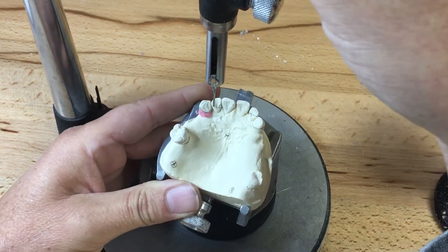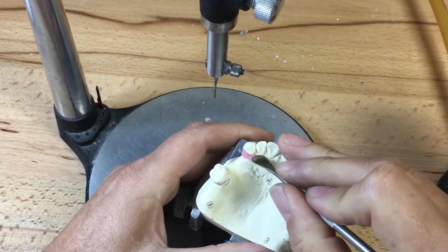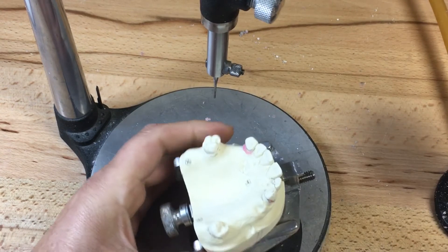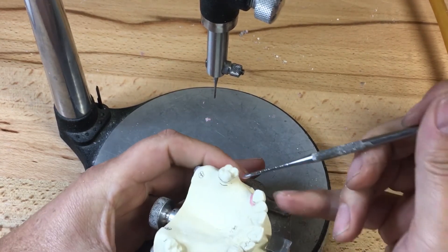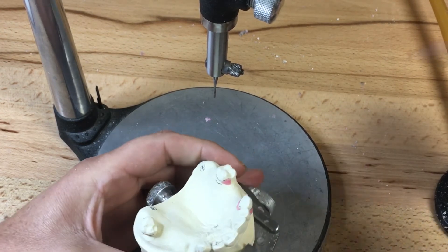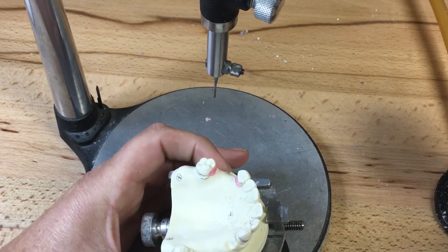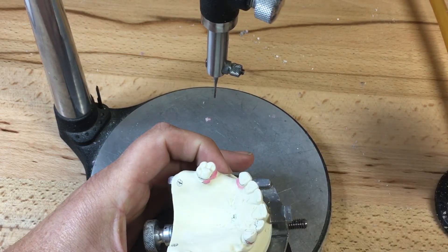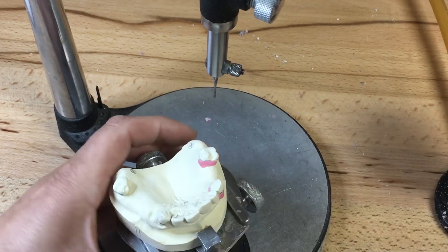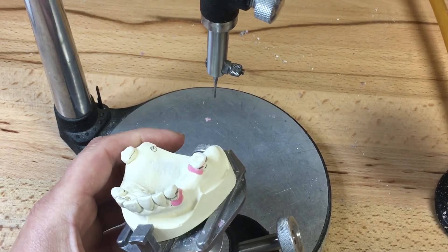This ledge will be replicated in my refractory model, therefore making it a lot easier to fit the framework post-casting. We can also choose to make our duplicate model prior to blocking out or after. If I'm going to use a hydrocolloid duplication method, I'll probably duplicate my model after, to ensure I have a suitable casting. If I have a silicone duplication, then I can go ahead and do that prior, because I'll have a permanent silicone duplicate of my block-out.